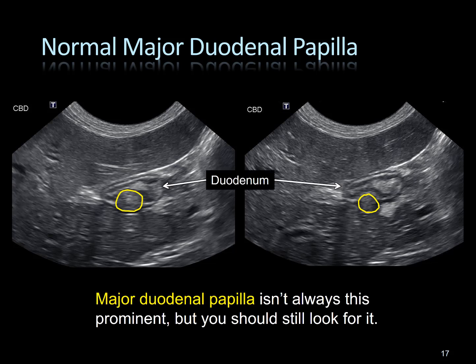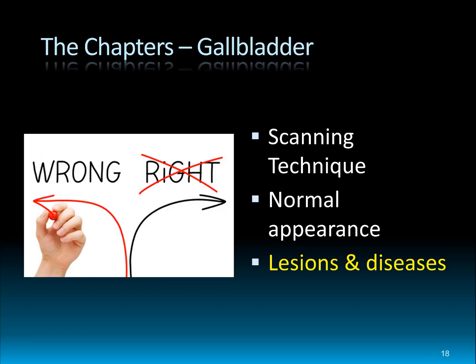And again, you should always look for it. Is there a mass there? Is there evidence of obstruction from a stone there or anything like that?